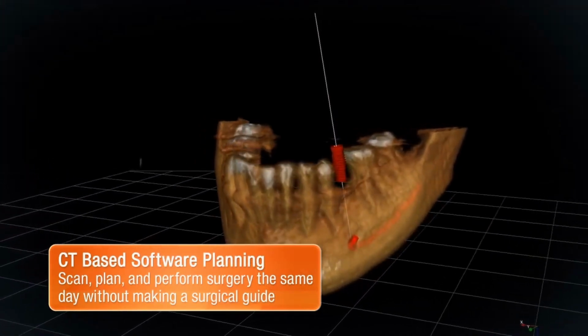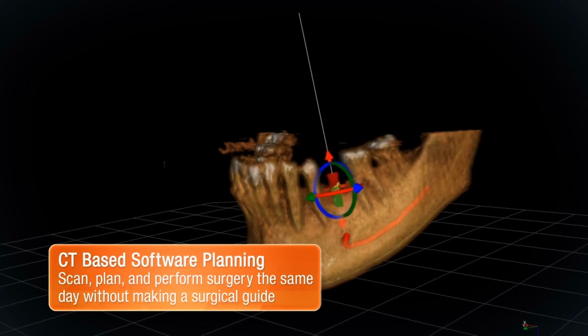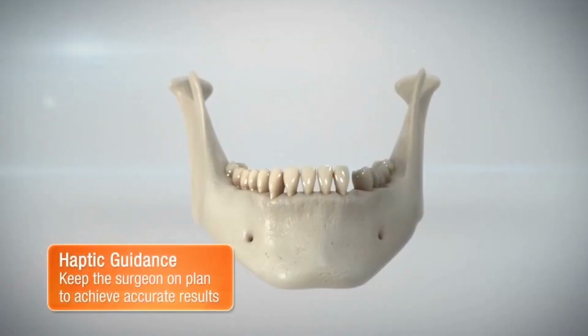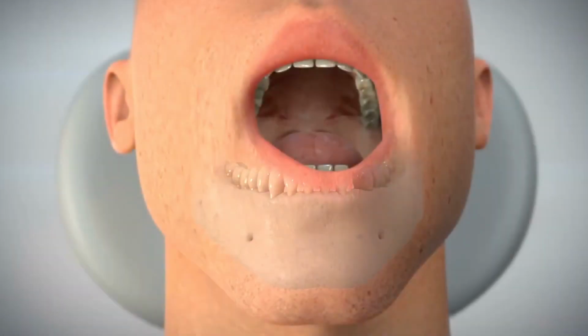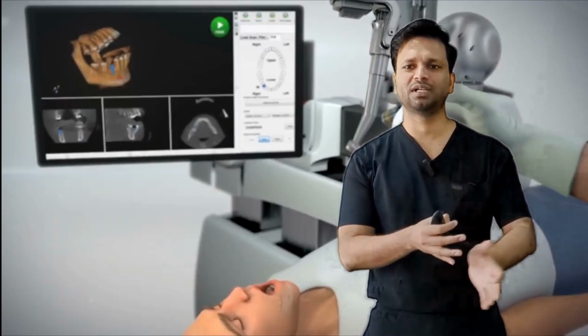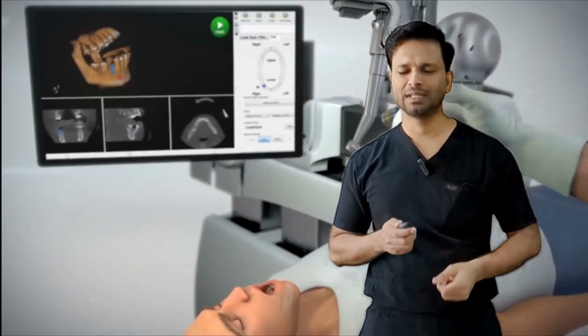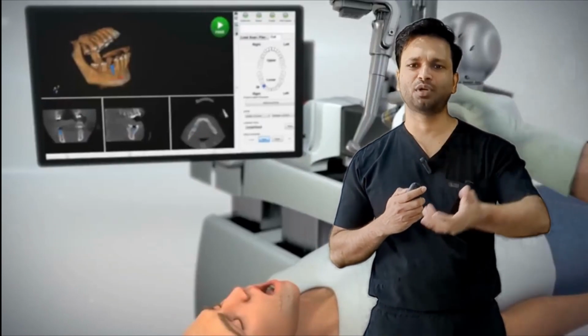Initially we have to do the virtual surgery planning. We have to tell the software that I want to place the implant here, and my osteotomy site, the drill bit, is going to go up to this depth, in this angulation, this depth. Now, once we have fed the computer that data, that I want the surgery done this way, the computer is going to help you.